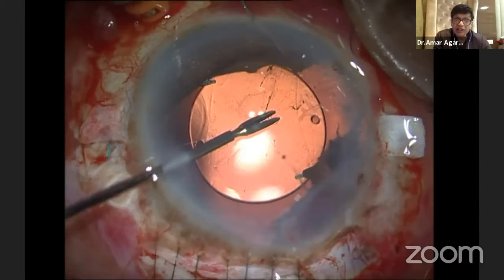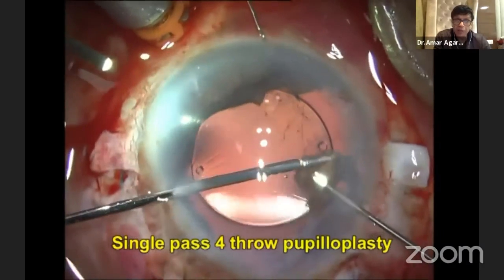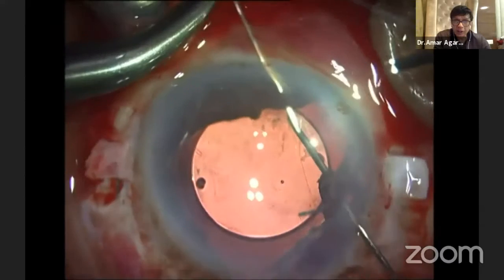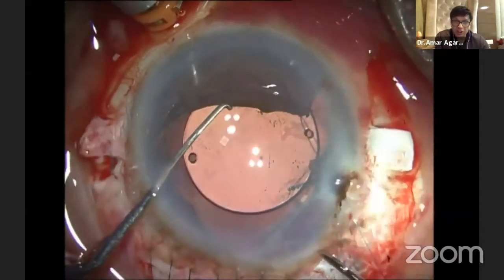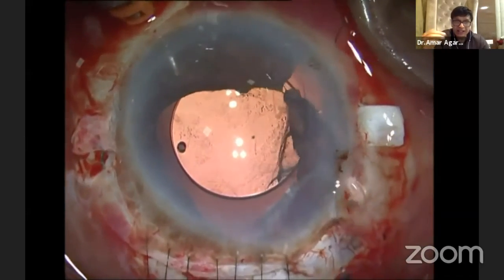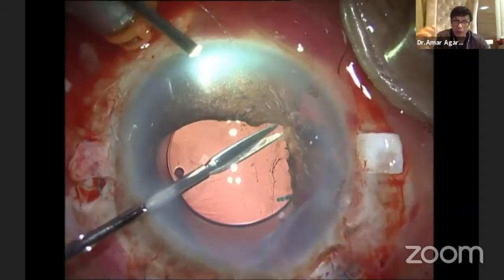Now watch — I have created a bad iris defect. So I'm using the single-pass, four-throw pupilloplasty. You can see now with one needle it doesn't need a paracentesis on the side where the needle is going in straight. You need a paracentesis only on the side where the loop is going to come out. From the other side, I've taken a 30-gauge needle through the paracentesis. Remember the name: single-pass, four-throw pupilloplasty. And that is game, set, and match.